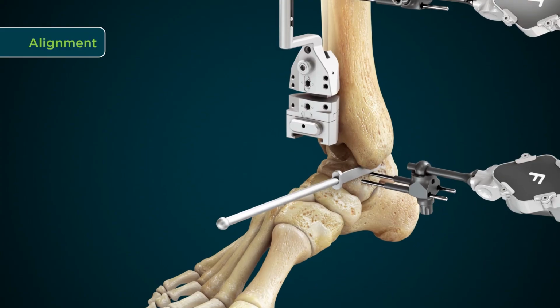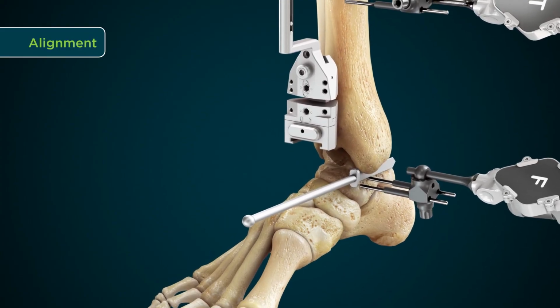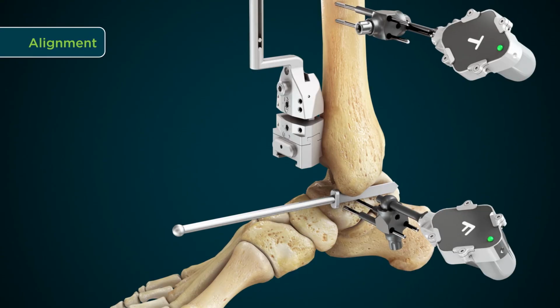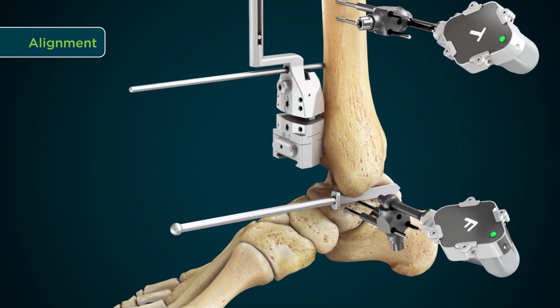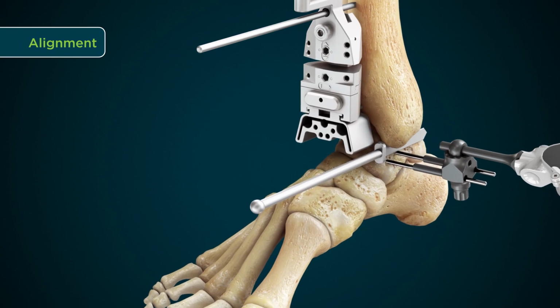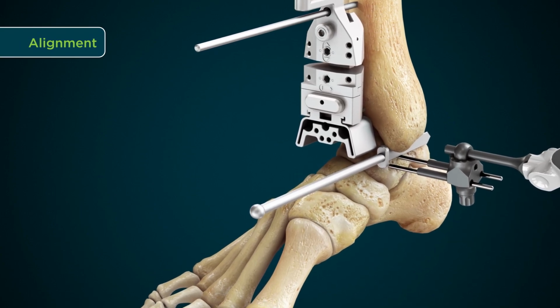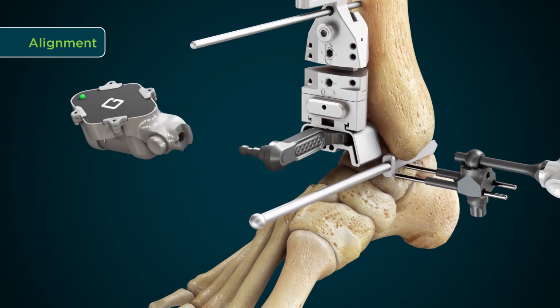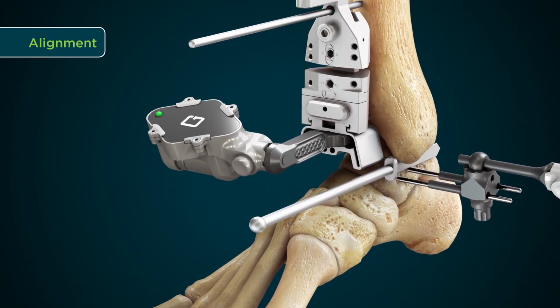Use the medial shim to align the tibial tubercle pin. Then place the pin into the tibial tubercle and through the proximal hole in the total ankle alignment guide. Insert the tibial cut block into the alignment guide. Then, insert the tibial cut tracker into the tibial cut block and attach the G-tracker.